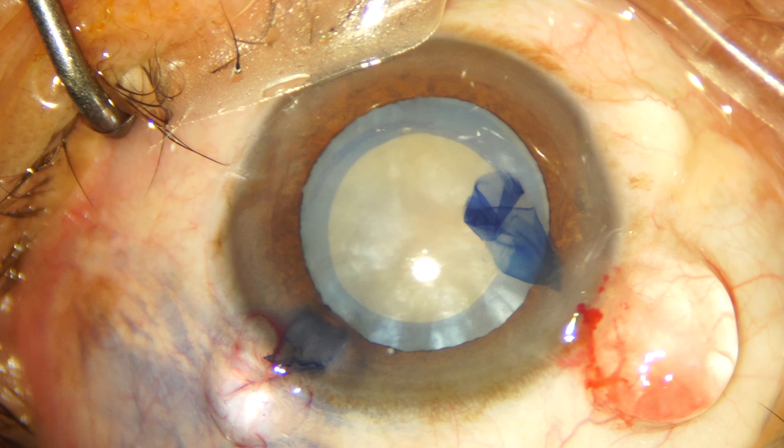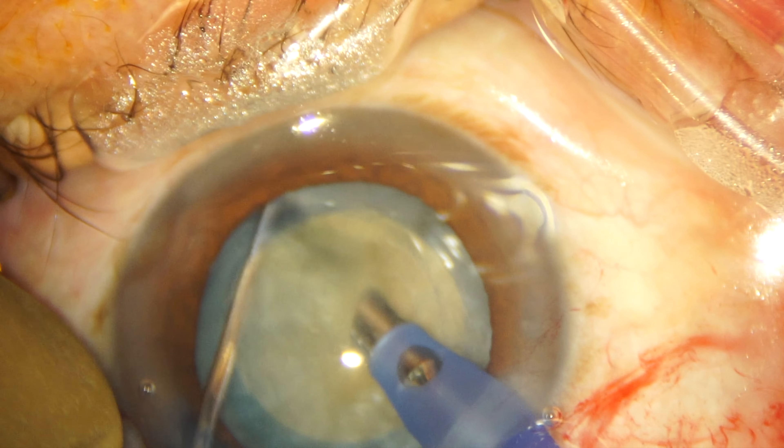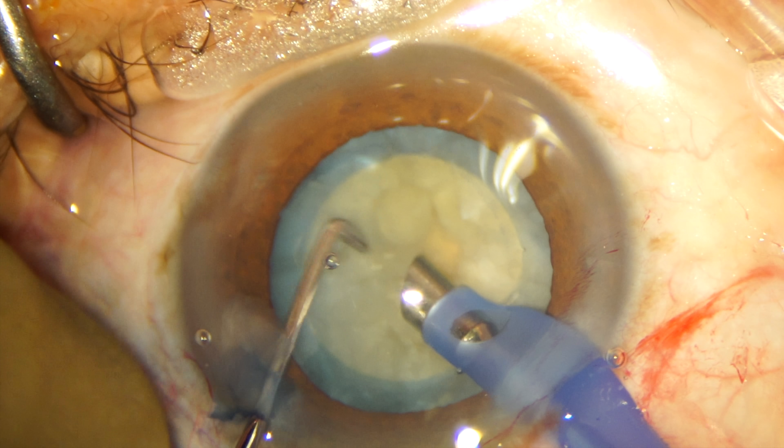This is a dense cataract that has some leathery components, so as demonstrated in my previous videos we are going ahead with the multi-planar chopping technique.